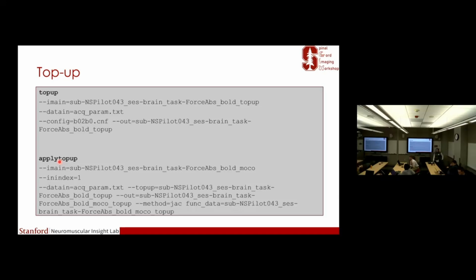I have a question related to this. When you acquire the data slice-wise from the brain to the spinal cord, do you alternate between brain slice and spine slice? We alternate. At the beginning, I mixed the two together, odds and then even.